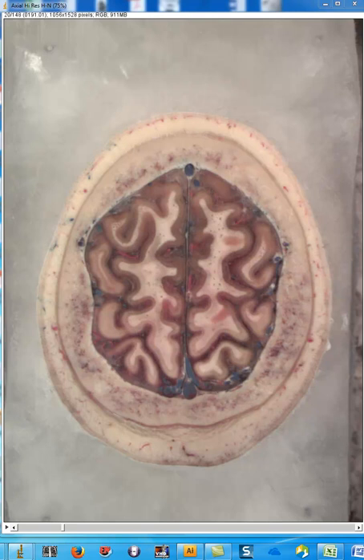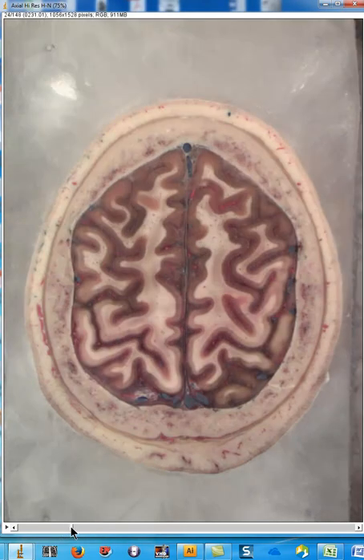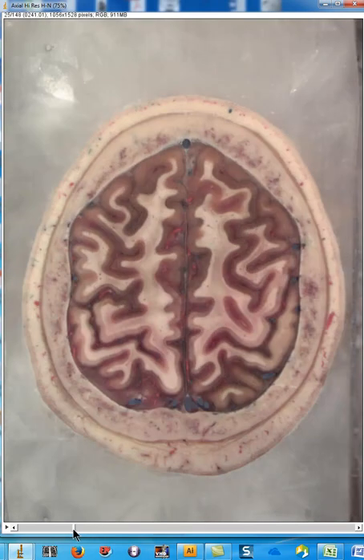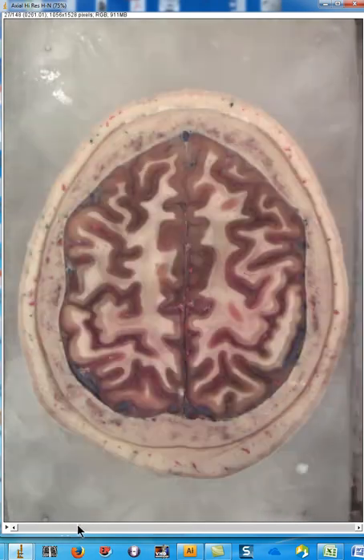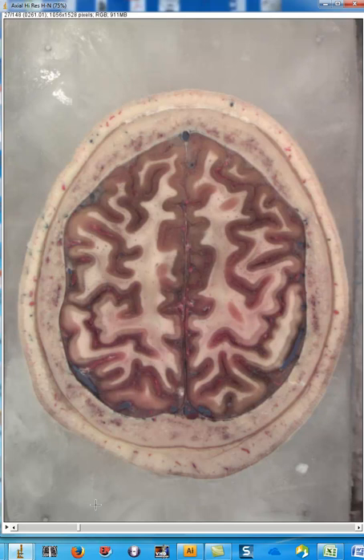Let's start by finding the precentral gyrus. The easiest way to find it is to find a structure called the hand bump, which is right here. This is the precentral gyrus right here, and the structure posterior to it is the central sulcus. Behind it is the postcentral gyrus, and in front of it is the precentral gyrus, which has the primary motor cortex on it.